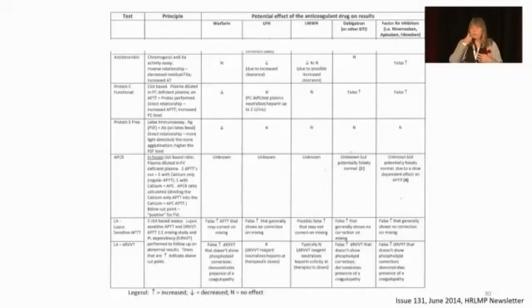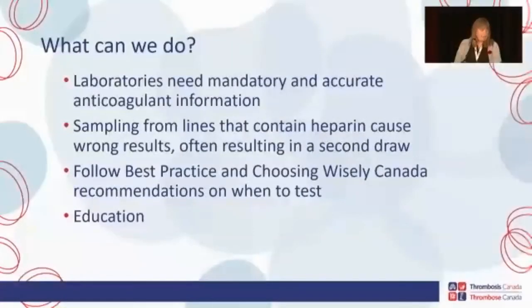And so this again was a piece of education where we put the principle of the different tests down the column, and then the impact. Again, this is not generalizable to all labs because all labs use different methodologies and different principles. But it's just a suggestion that laboratories do have an opportunity to provide excellent education on the impact.